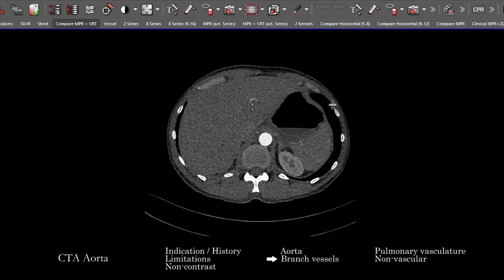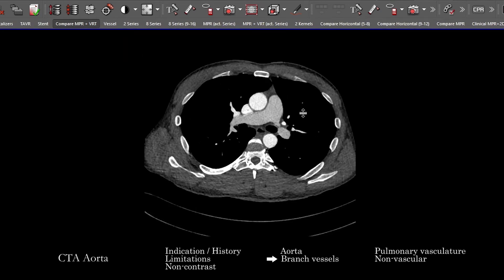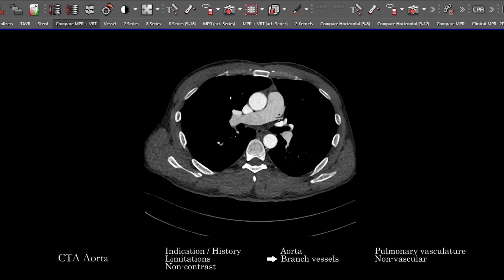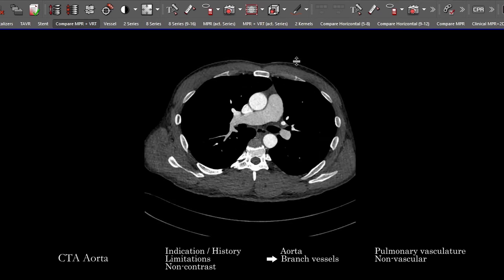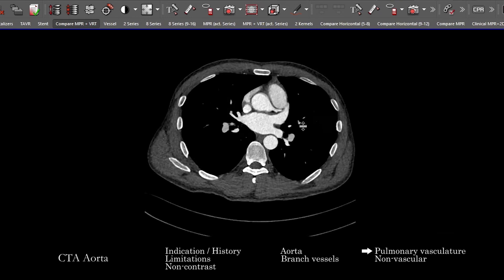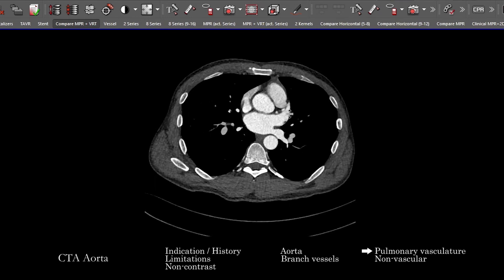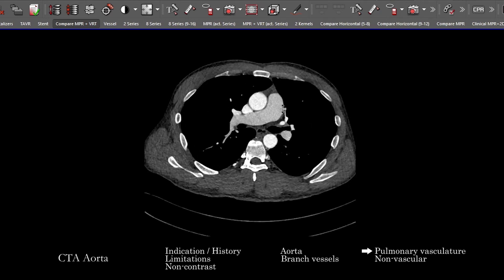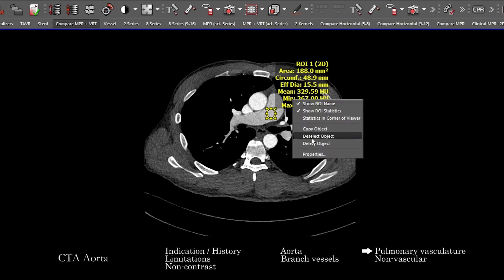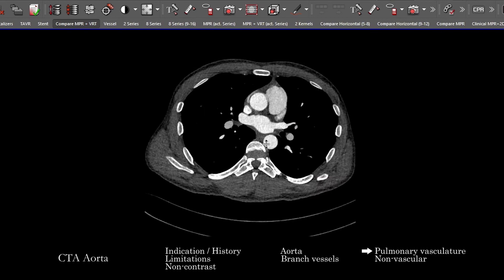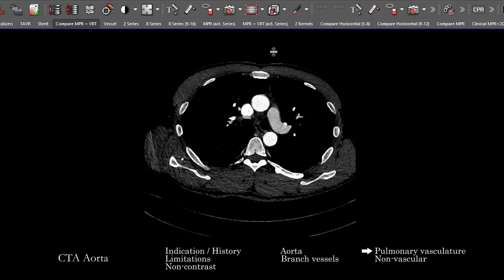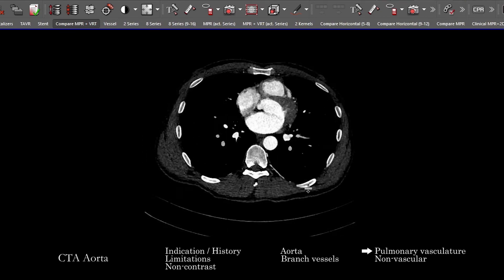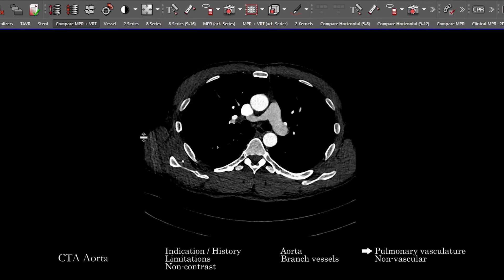An important thing to remember: depending on the institution, patient, and protocol, contrast will often fill the heart and pulmonary vasculature. It's useful to look at the left atrial appendage and to evaluate the pulmonary vasculature — while it may not fill to a great extent, on some studies you can see contrast filling the pulmonary vessels well enough that a central pulmonary embolus would be visible. Make sure to assess this.